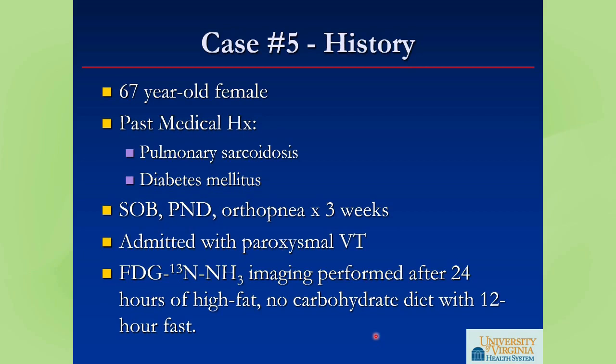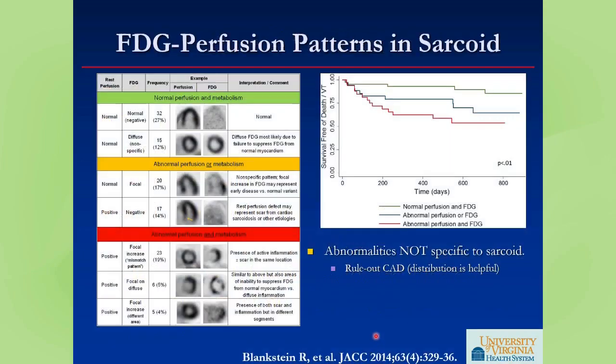But the good news is that if you do this very intensive patient prep, you basically eliminate any typical physiologic uptake of glucose by the heart muscle cells. And so the only cells that take up glucose are those that are obligate glucose users, such as neutrophils. So you can see inflammation. And so this particular patient prep for metabolic imaging is to assess for patient inflammation.